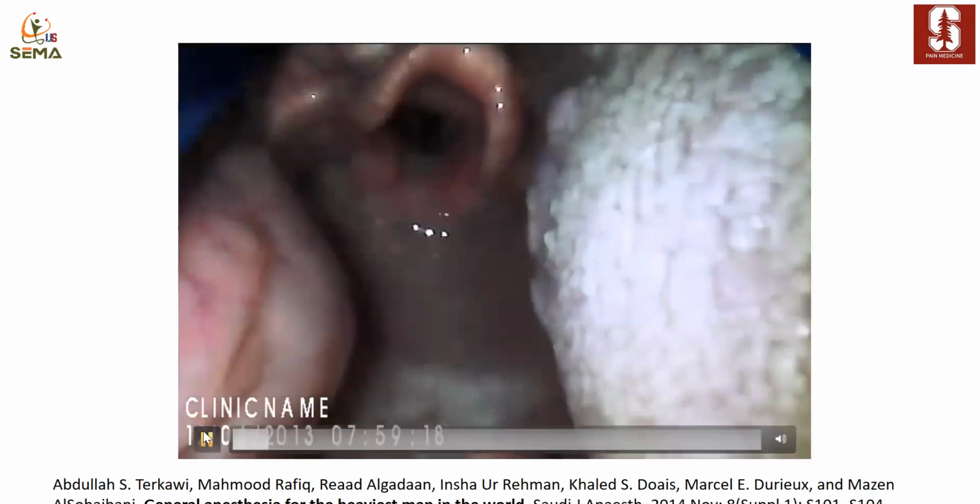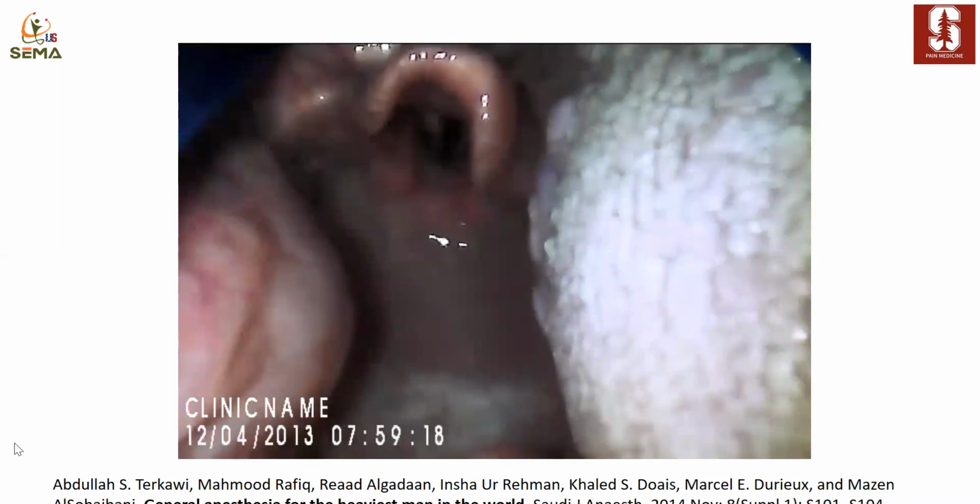So this is what we did. As you see here, that's December 4th, 2013, just around 8 a.m. So this is a video laryngoscope. We used a GlideScope. This is the tongue, and this is the grade. I would call this almost grade 1, but as you will observe now, it goes back and forth between grade 1 and 2B.